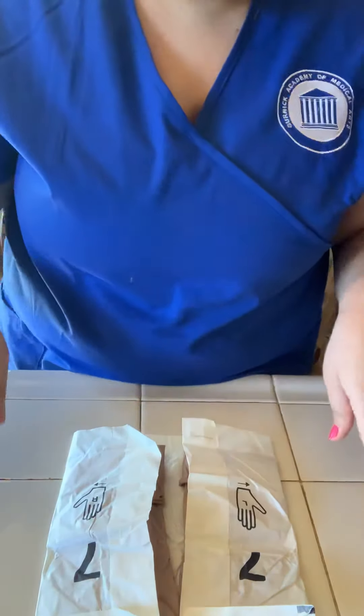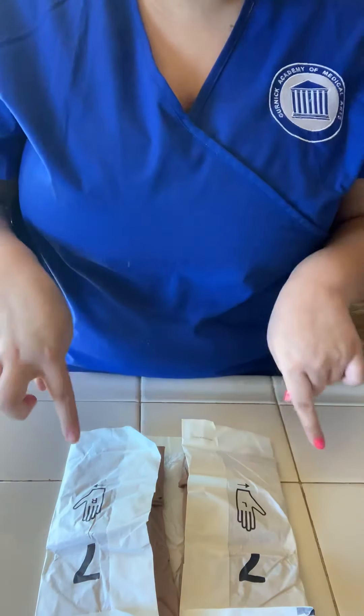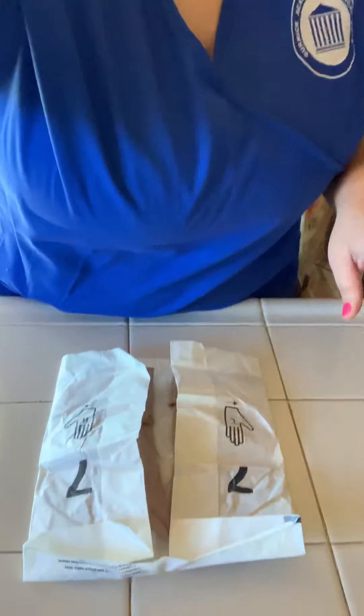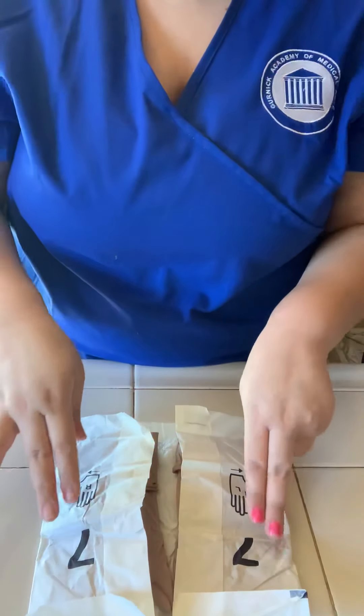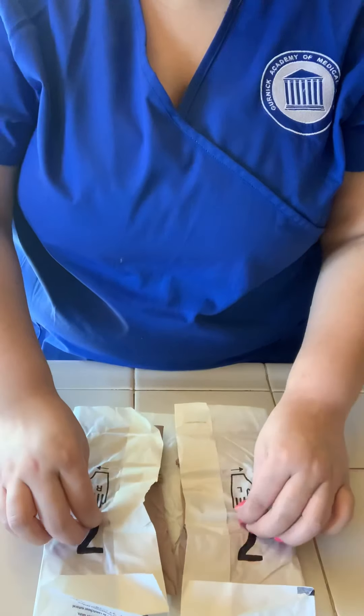Once we begin opening them, I'm going to go ahead and open them like this. I'm going to pull it out of the wrapper just like this. I want to make sure that I don't grab this area right here because this area is not sterile at all. The areas that I'm able to work with are anything but this right here, so I'm just going to go ahead and open it this way.